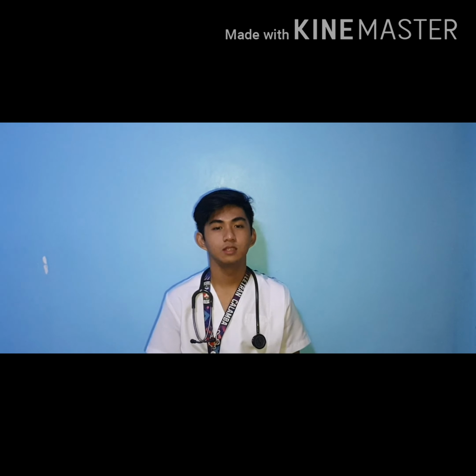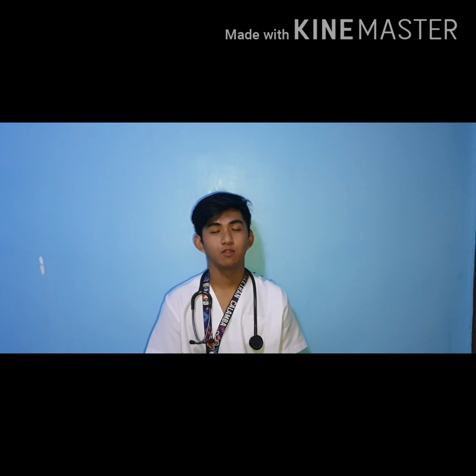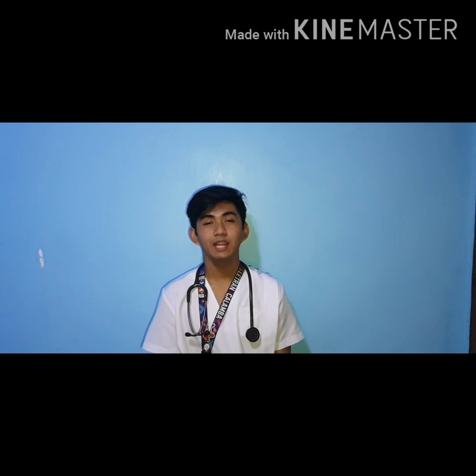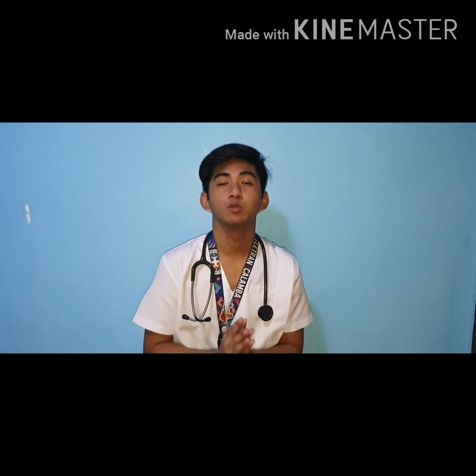Good day everyone! I am going to discuss how to assess eye structures and visual acuity. In preparation, the first thing you need to do is to assemble equipment and supplies: cotton tip applicator, examination gloves, millimeter ruler, pen light, Snellen's chart, opaque card. Now, let's proceed to the procedure.